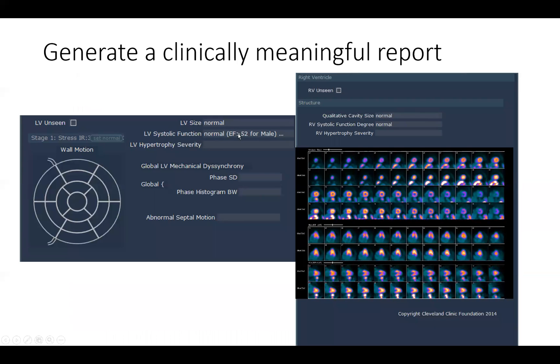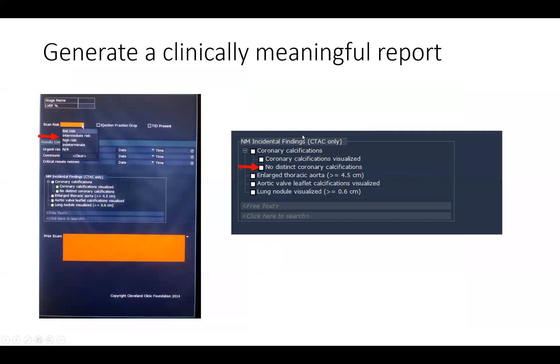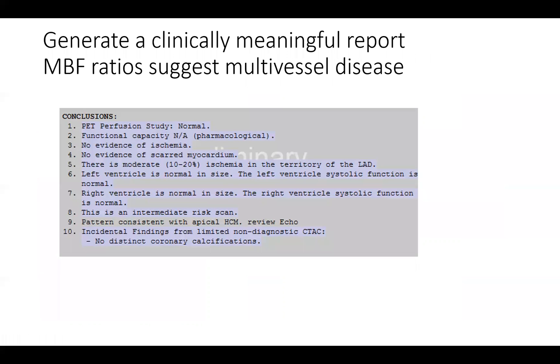Left ventricular function was normal and we will score the wall motion abnormality in the apex, which you can see on the right hand side here. We remind ourselves that this person had ischemia in the left anterior descending artery territory, so we scored that accordingly. This patient had no coronary calcification, so we scored that as none. We scored this stress test as intermediate risk because of the presence of a moderate amount of ischemia and that focal LV cavity dilatation.